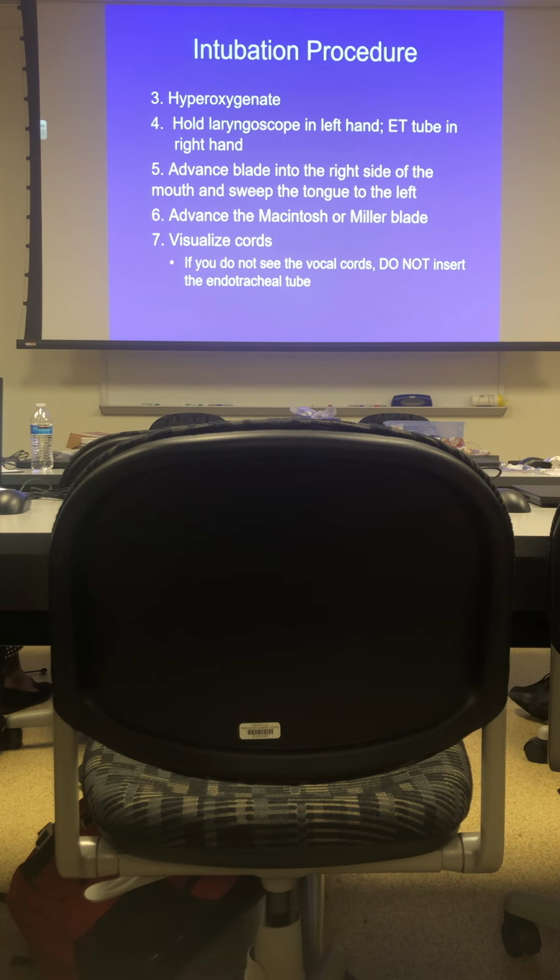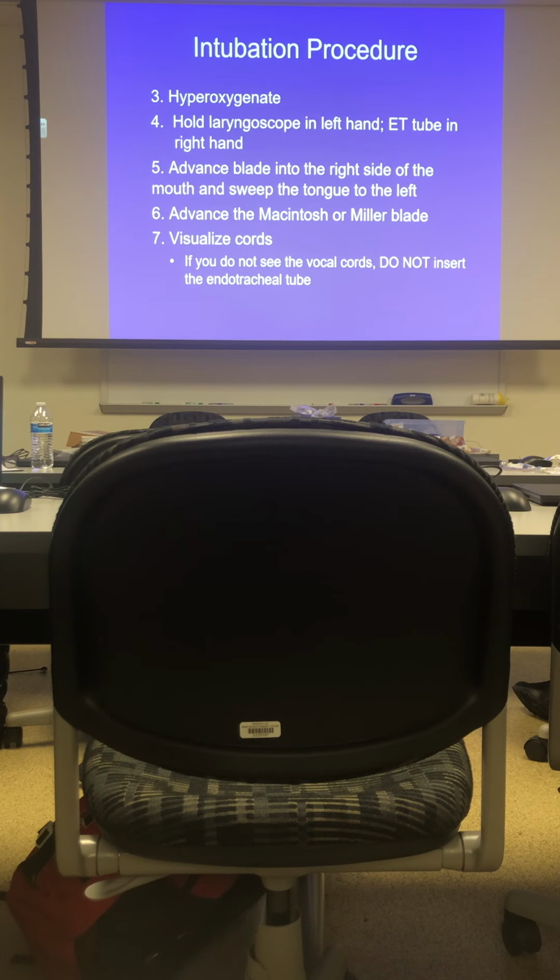So let's say he's trying to intubate, and he's not checking time or how long he's in there, and your patient starts to desaturate, okay? So he's in there, and he's really trying, and you're going below 90%. What do you think you would do? So you tell the physician, hey, we need to stop and we need to give them some oxygen. So you're gonna bag them, okay? You're gonna give them some breaths with 100% oxygen at 15 liters to get their sats back up, and then we'll try again. So he's counting on you to pay attention to the patient, all right?